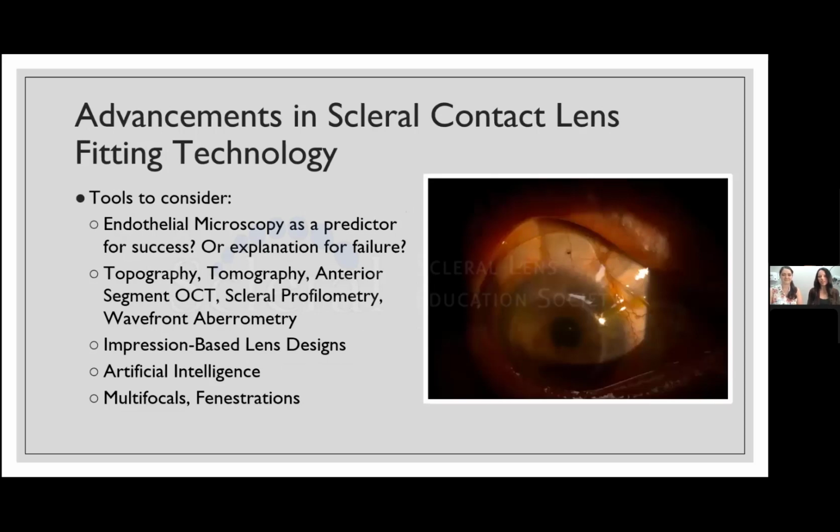Some of the tools to consider that are maybe newer technology that we're going to talk about include things like using endothelial microscopy as a predictor for success, or explaining failures. So we've got a case report to share with you that looks at this topic.